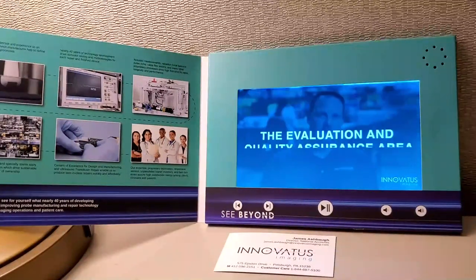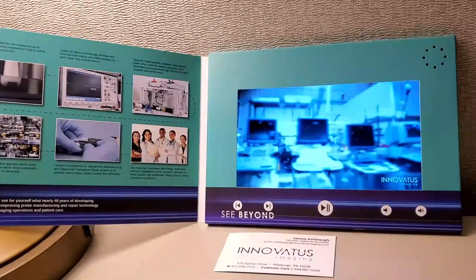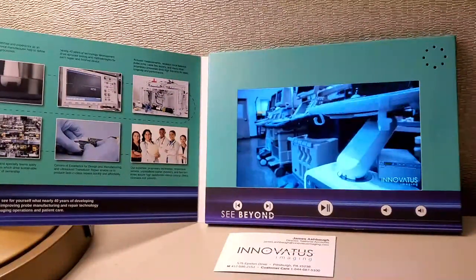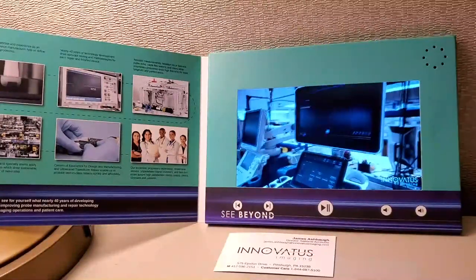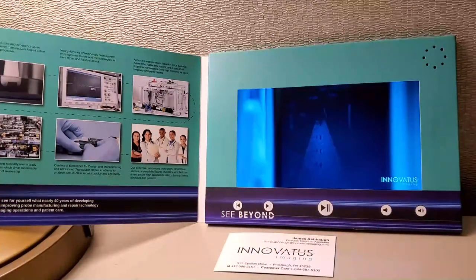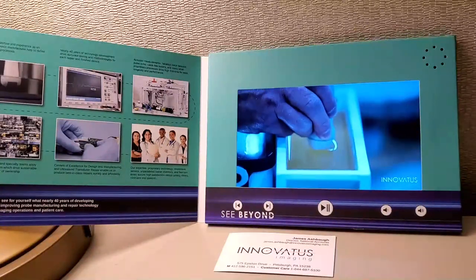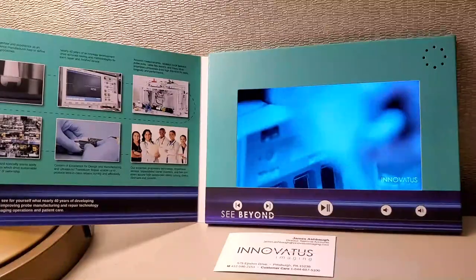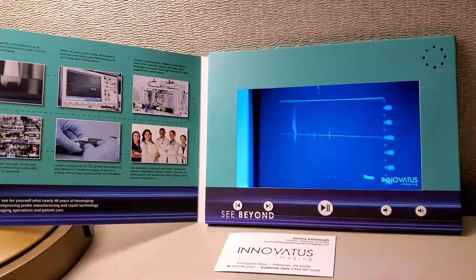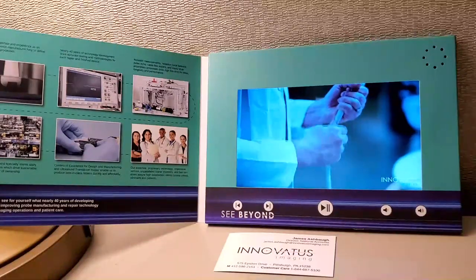The second stop is the evaluation and quality assurance area. When a probe arrives, it gets a thorough set of testing using proprietary equipment and testing procedures. We also want to see it just as the customer sees it in the end-user scenario — on the system itself. The function test is extremely important; we want to see what the customer sees when they pull equipment off the line and send it in for repair. When a probe is finished and ready to go back to a customer, this area handles additional function testing, image testing, quality assurance testing, electrical safety testing, and more.